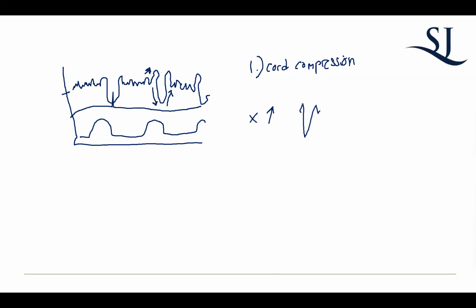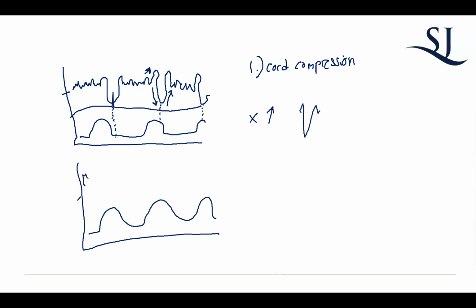And they're not related to the contractions. I know it kind of looks like it is here, but this one is at the end. If you actually look, this one is kind of on top of it. So it's not related. And this one's almost directly on top of it. So they're not synchronous. A late decel would look like this. Say it's like that. You see how it starts just as the contraction ends. And that is indicative of uteroplacental insufficiency.